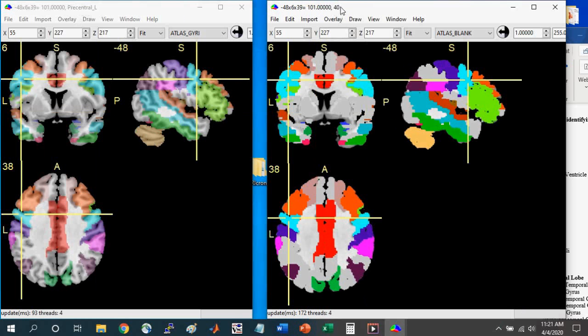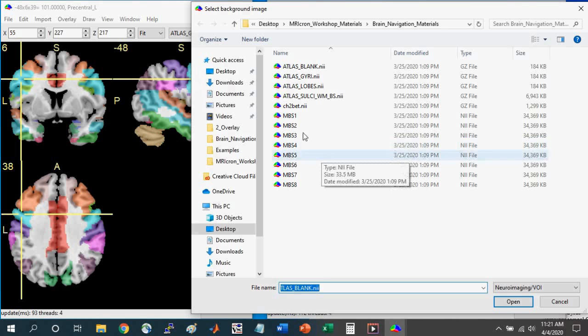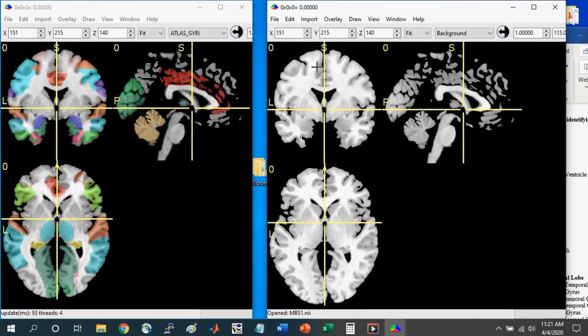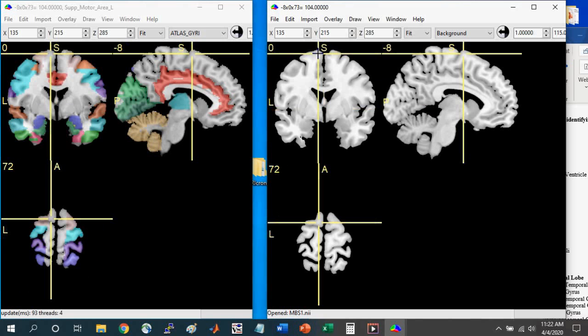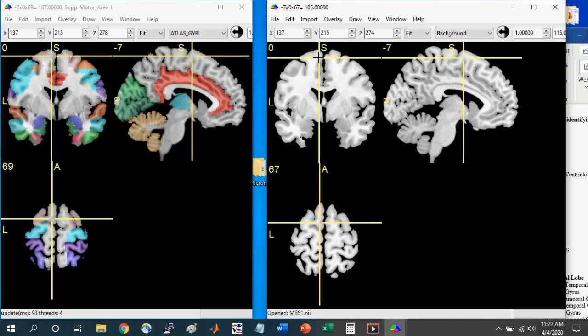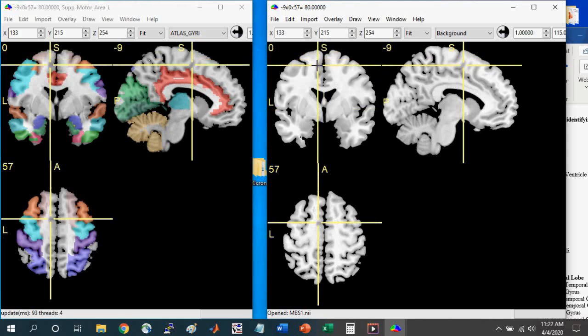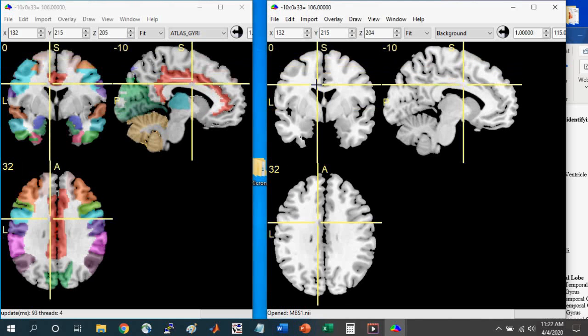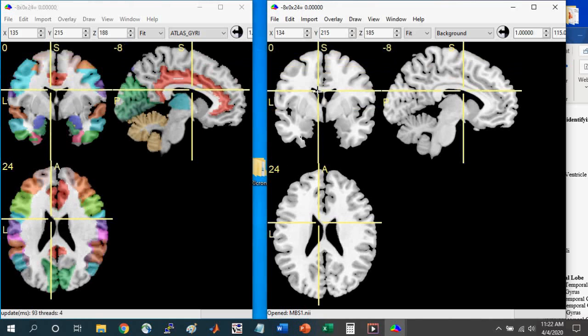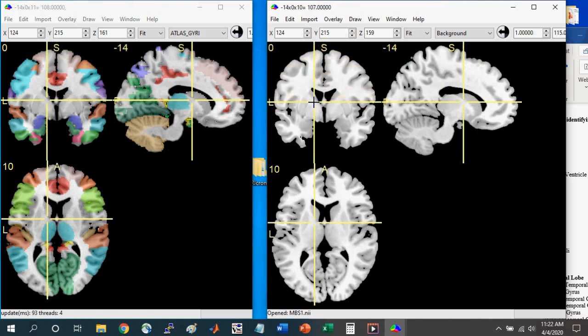The other set of resources you can use are the brain files with missing brain structures. So if I go to file, open, and I select the MBS 1, this is missing brain structure 1, there is a structure that is missing from this brain. And the exercise is to identify this brain structure. The best way to do that is to left click up at the top and just hold and scroll down. And you're seeing in the axial view, the slices are changing as I'm scrolling down in the coronal view. So I haven't identified any missing brain structure yet. These structures are the ventricles. And so they're supposed to be there. There's supposed to be darkness there.